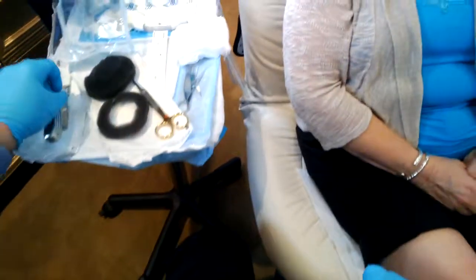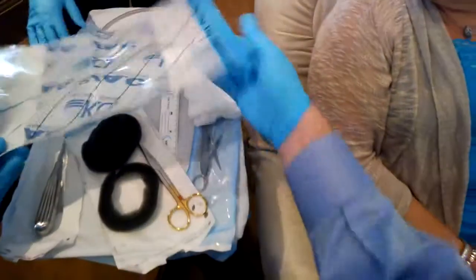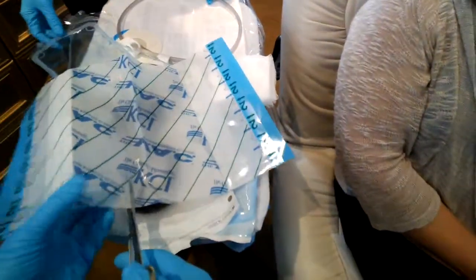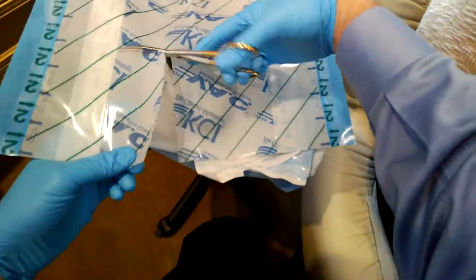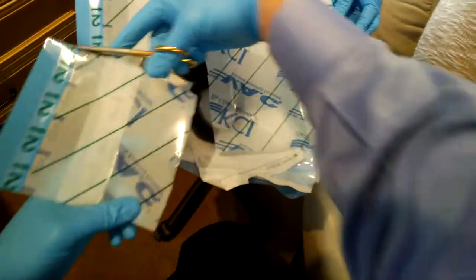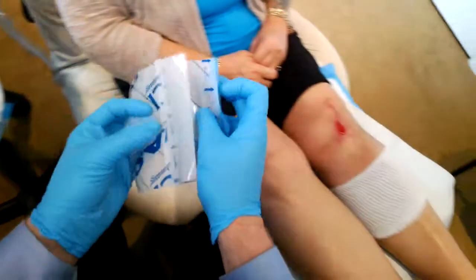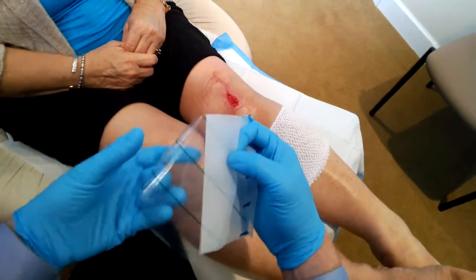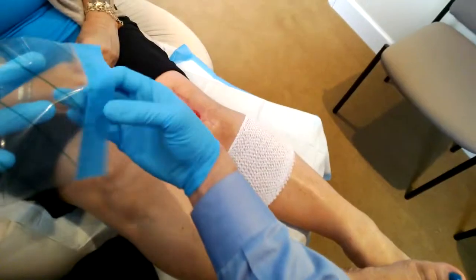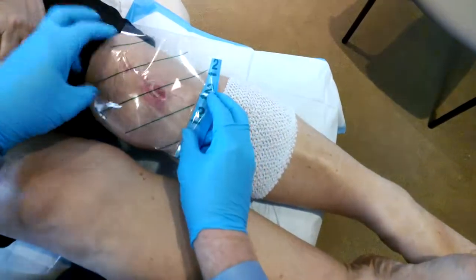The next thing is we're going to use our sticky drape. I'm going to take my scissors and just cut a patch out here. This is going to go onto the skin, and then we're going to put the sponge directly onto the wound. So this is our first step in placement of the wound vac — our sticky drape. I'm just going to undo that and put this directly on the skin, just like this.